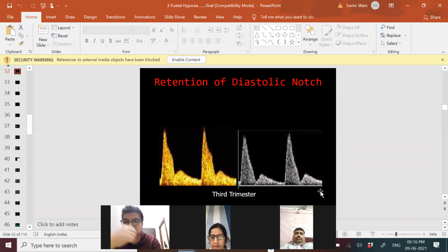Now, how that will be picked by ultrasound, we have discussed it in our course. There will be this systole, and this is the diastole. Now when we are taking the index, I mean the S by D ratio of this systole upon this diastole. Dr. Joseph, do a simple math. For 2 minutes, you are not a doctor. You are simply doing math.